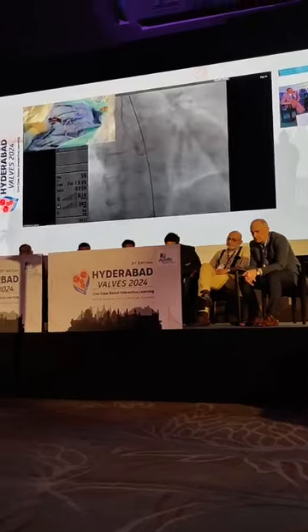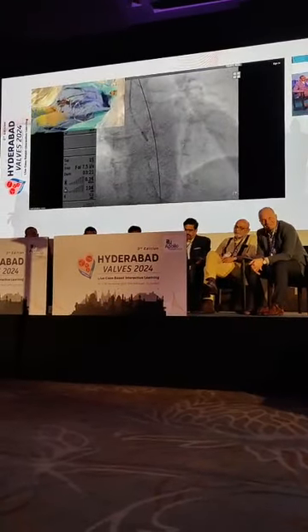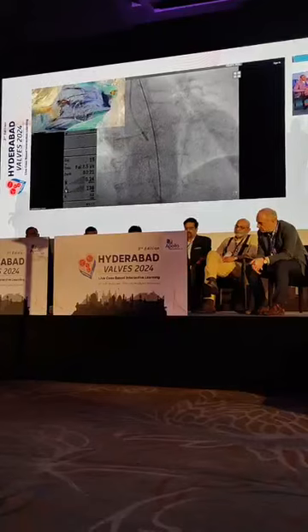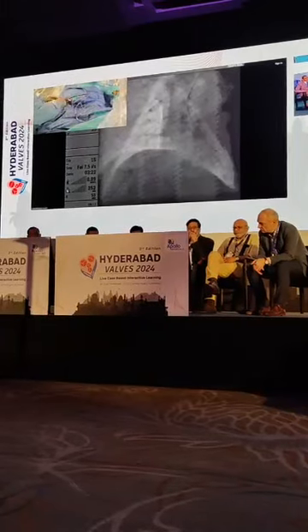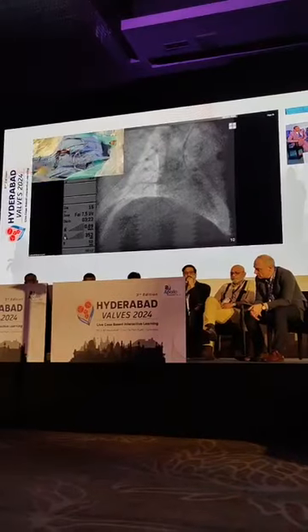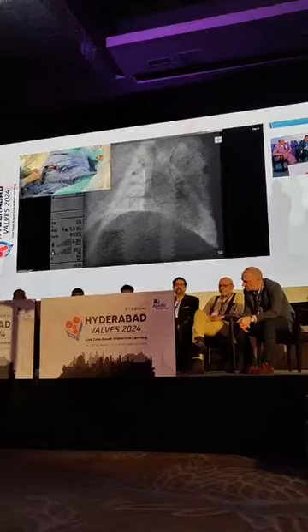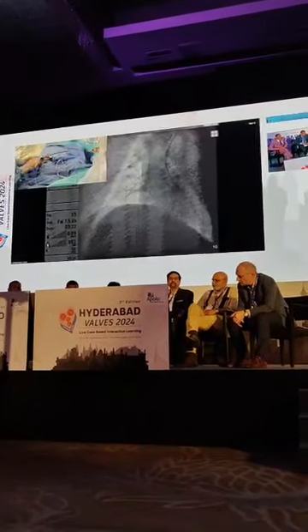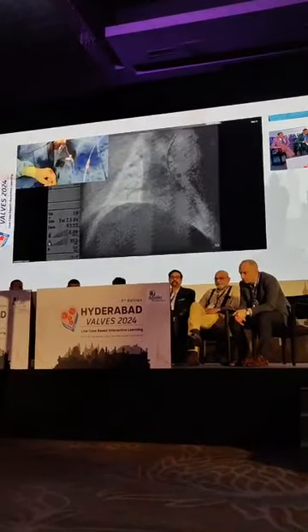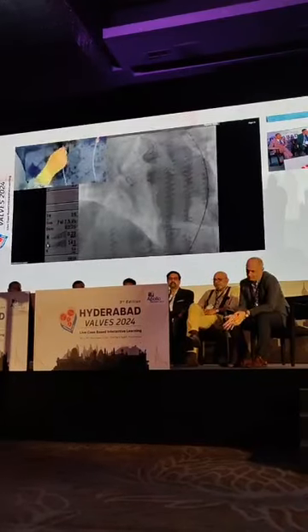So now it's time to cross the aortic valve. And you know that Alain Cribier had a technique. All of us learned, and he taught it all over the world. It's to use an AL2 left catheter, which is advanced over the wire in the LAO projection. So we move to LAO. We advance it over the wire.